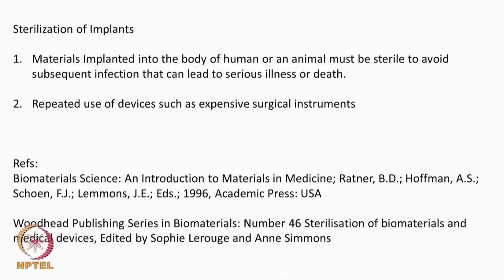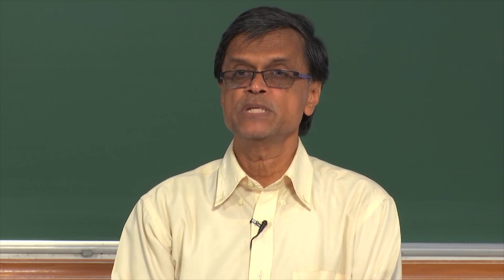Sterilization of implants. Materials implanted in the body of a human or an animal must be sterile to prevent infection, which can lead to serious illness or death to the host, number 1. Number 2, if we are using expensive instruments, we do not want to throw them out. We would like to recycle them, so we need to sterilize. Whereas very cheap instruments like catheters, syringes or needles can be disposed of, but very expensive instruments of course you need to sterilize.